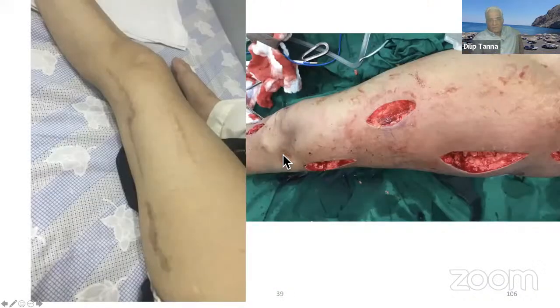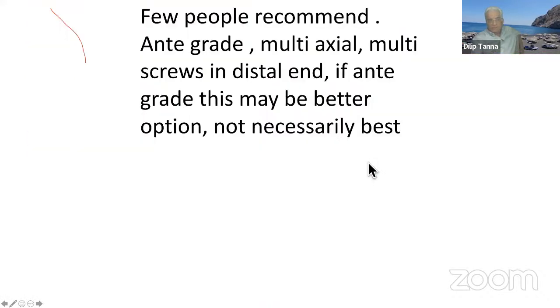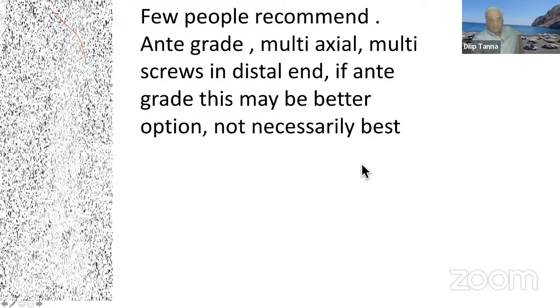Now, why I'm doing this medial plating is, this is the way I do it. I open up, seeing on the C-arm, on the bone just on the medial side. Open it up, cut the muscles, and still remain on the anterior medial side. A single anterior medial, posterior medial, medial approach, then put the graft there, and then put in a plate. Few people recommend antegrade multi-axial, multi-screws in the distal end. If antegrade, this may be a better option, not necessarily the best.